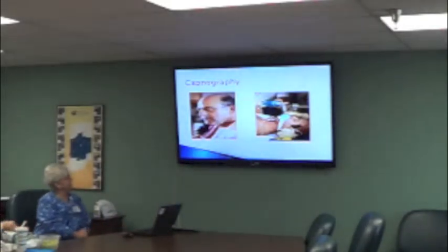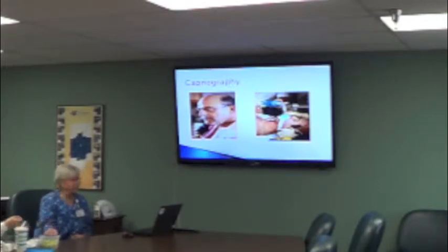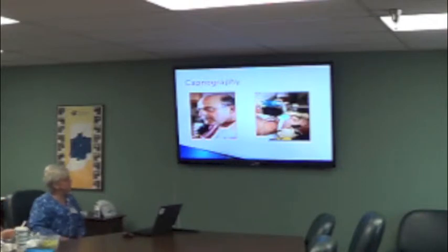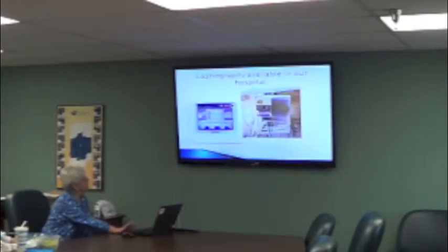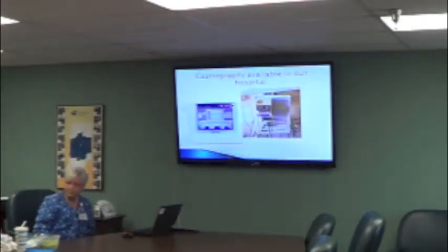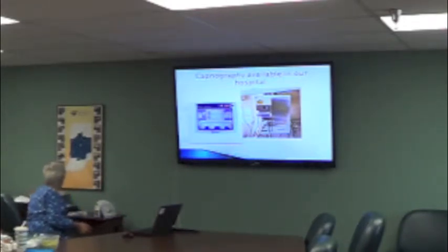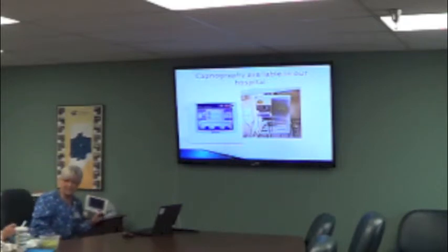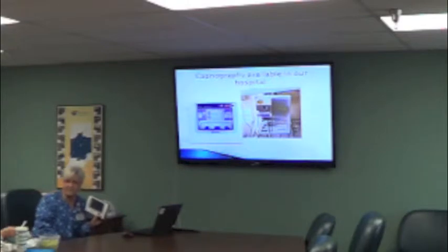The two ways that we can measure capnography here, and also the third way would be in surgery with the anesthesia machine. But we can do it through a nasal cannula, and we can also do it through an adapter when someone is intubated. These are the two different monitors that we have, and I'll go over the monitors. This monitor here, each unit has one of these, and we have a lot of questions about alarms and the correct way to use this, and the sales rep is coming in next week and giving us an in-service on that.